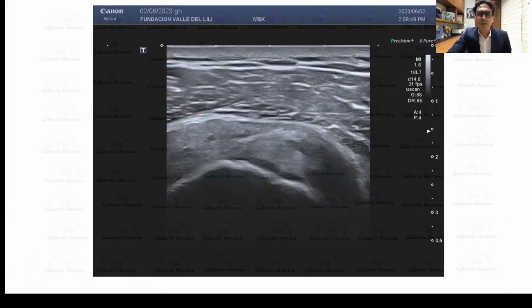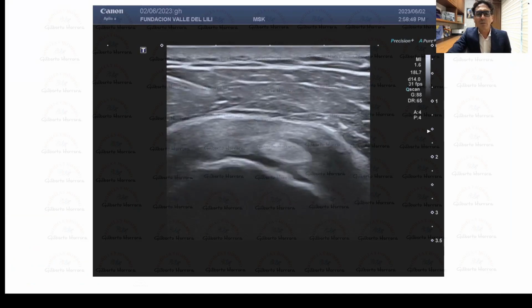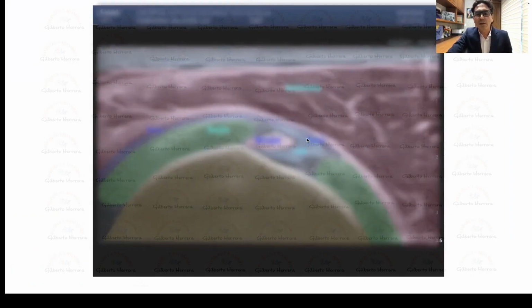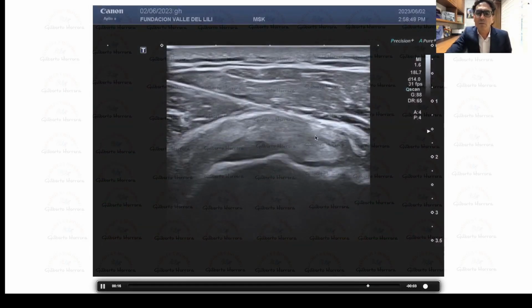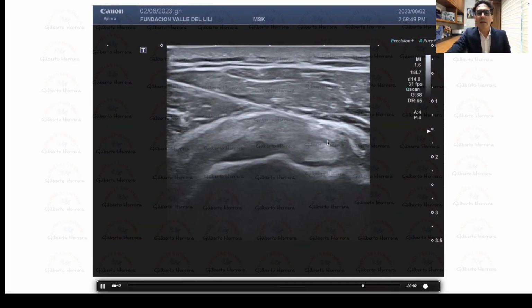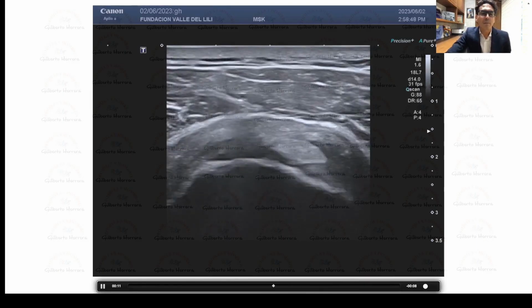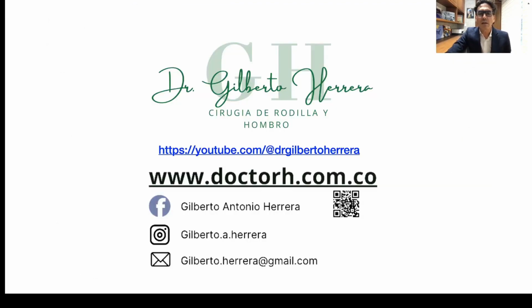Let's look, for example, at adhesive capsulitis. This is an ultrasound for treatment in interventional procedures, which we will see later. But if we clearly reference where the pathology is, which you already know well, and there is a lecture about it, we can perform the intervention at the level of the capsule and the ligament, which are the areas that clearly harbor pathologies like the one I just described. We'll cover capsulitis in a lecture. Rotator interval, a sonoanatomic structure to study in our module.